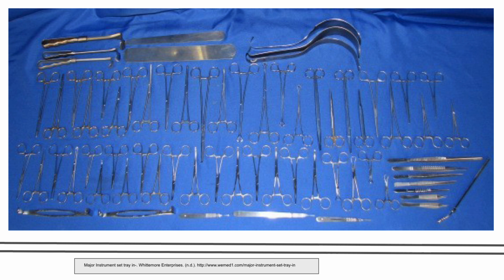Instruments used for this procedure include curved hemostats, Kelly forceps, Alice forceps, number 3 knife handle, Metzenbaum scissors, straight Mayo scissors, DeBakey's, tooth forceps, Adson forceps, Bookwalter, Army Navy, and Richardson retractors. Suctioning includes Yankauer and Poole, Mayo Hegar needle holders, and skin stapler.